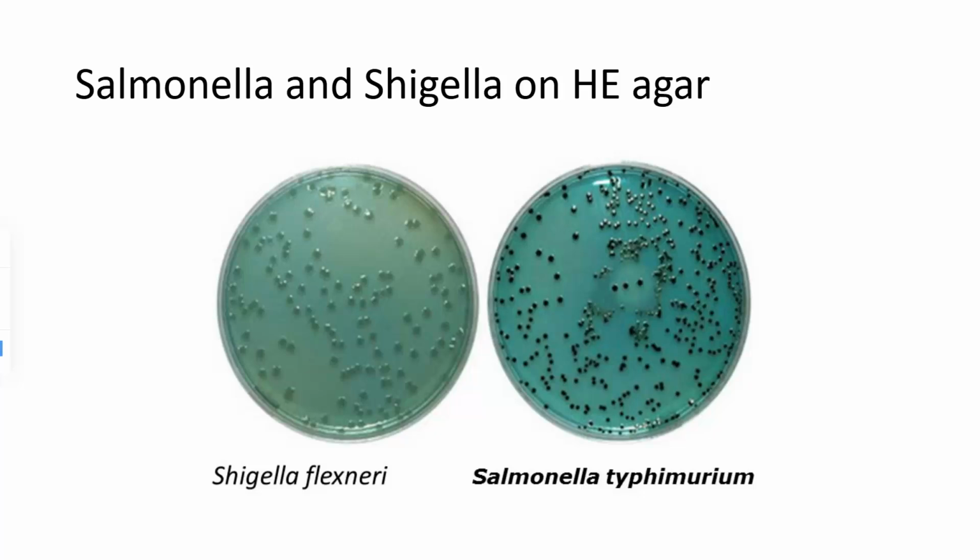There's a bunch of others, but also the Microscan or Vitek 2 analyzer, those two use biochemicals to identify. Those can help differentiate Shigella from E. coli. So structure-wise, they're difficult to identify, but biochemical-wise, we can distinguish them. And then here's that black precipitate for H2S production, which is indicative of a Salmonella species.